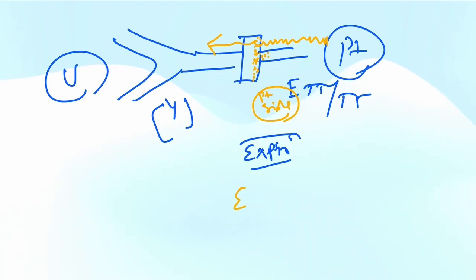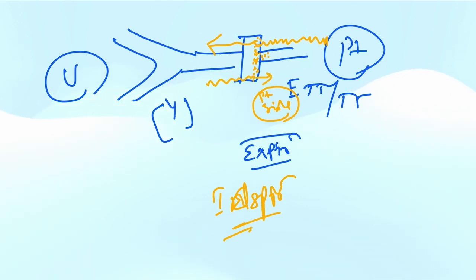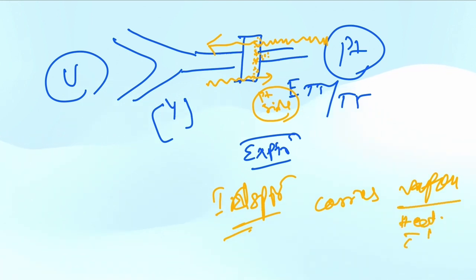So what happens during inspiration? When the inspired gas enters through the HME towards the patient, it carries the vapor and the heat with the vapor left during the phase of expiration along with that towards the patient, right? So this is the simplistic way of defining its function, right?